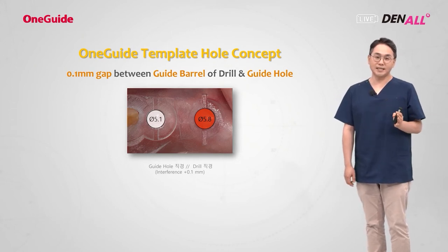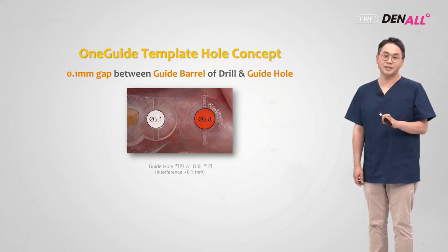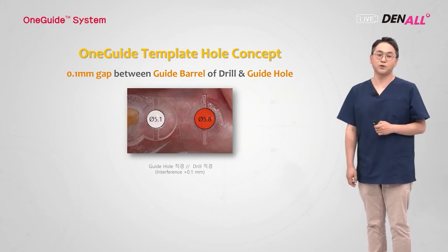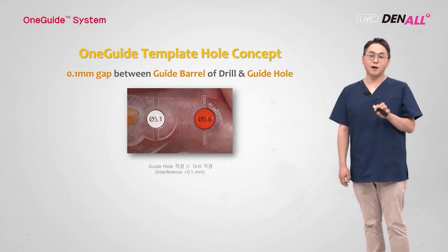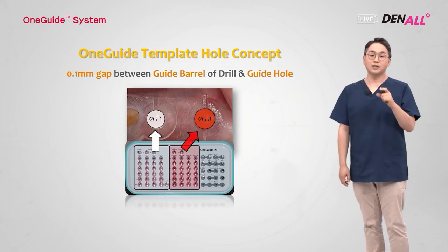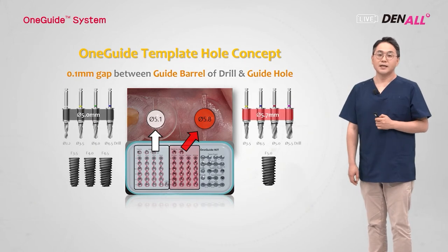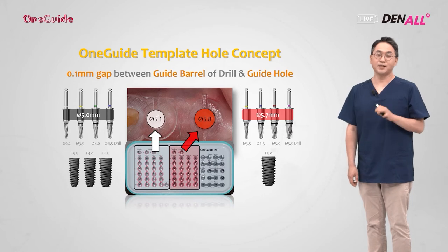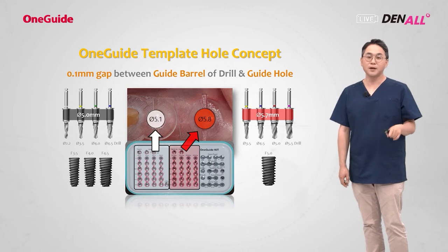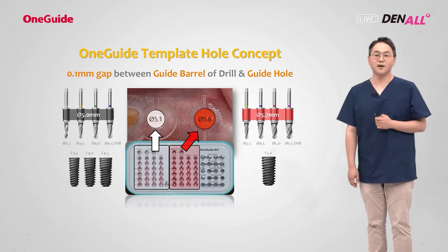When you place a 4.5 millimeter or less diameter implant, a 5.1 millimeter guide hole is automatically generated. If you place a 5.0 millimeter implant, a 5.8 millimeter guide hole is generated. So depending on the guide hole diameter, the size of the guide barrel to be used is different. That means when you place a 4.5 millimeter or less diameter implant, you need to choose drills from the left part. When you place a 5.0 millimeter diameter implant, you need to choose from the right side with the letter W.